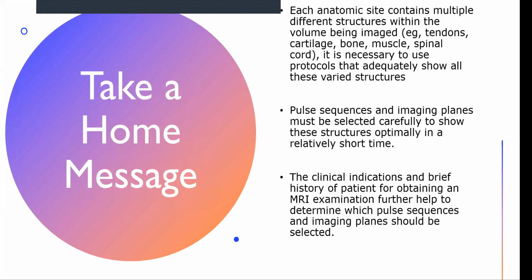And the last thing is that the clinical indication and brief history of a patient for obtaining an MRI examination further help to determine which pulse sequence and image planes should be selected. So please, when you don't know how to take the MRI, you can at least give a brief history for the patient in order to make a referral case or referral notes to your colleague with the MRI.